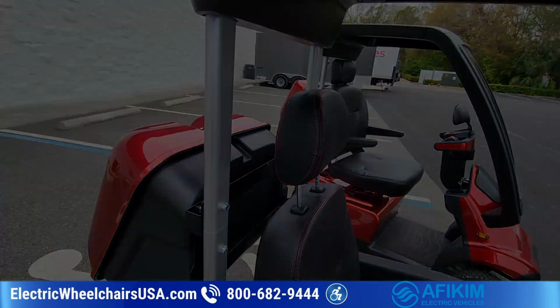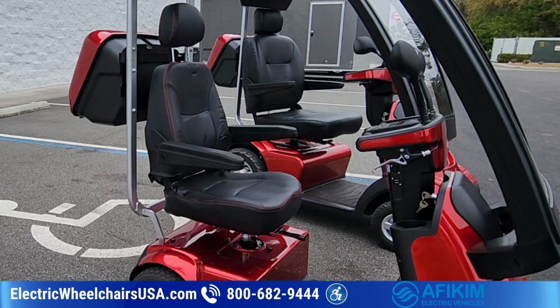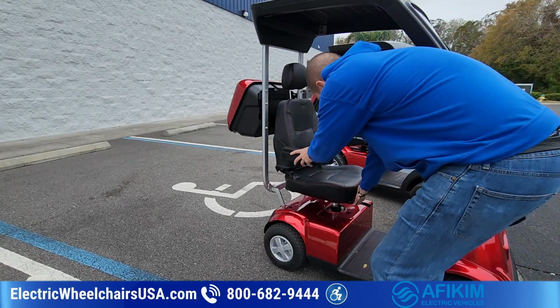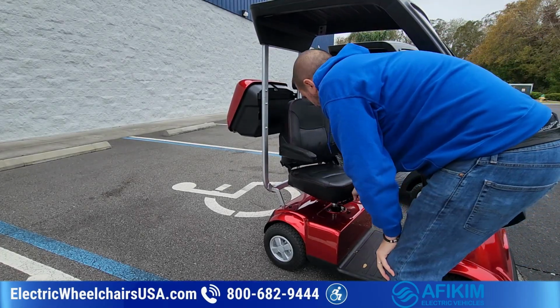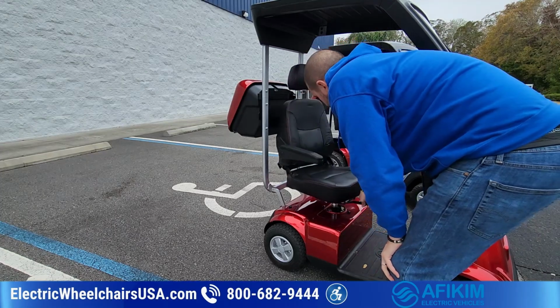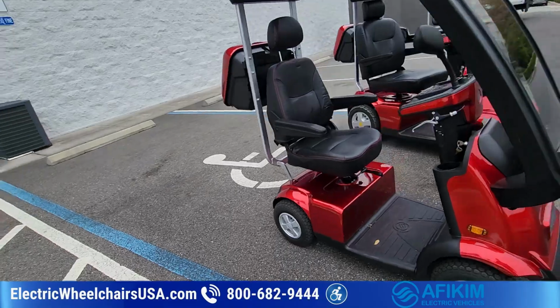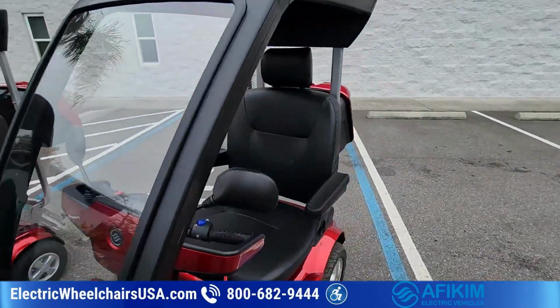So one thing I just learned on another video we were recording is these seats on both of these scooters will slide forward or backwards, and they also swivel. So on the C model, if I have it pushed all the way back, I can now swivel this. The old Canopy, you couldn't do that. Now with the S model, it's not the same. And another thing too, this is an optional seat.